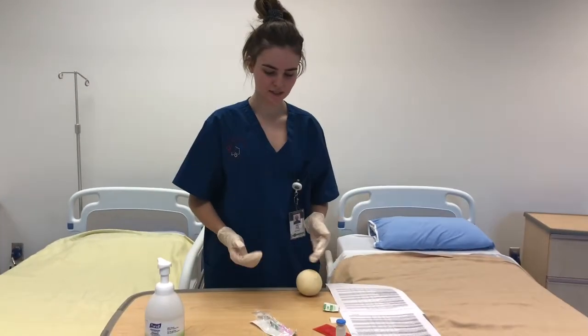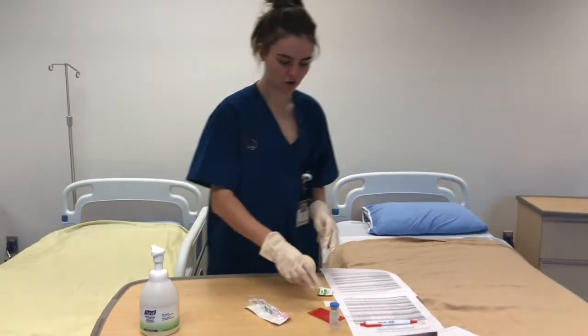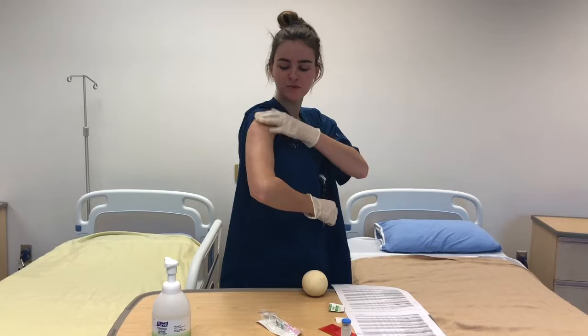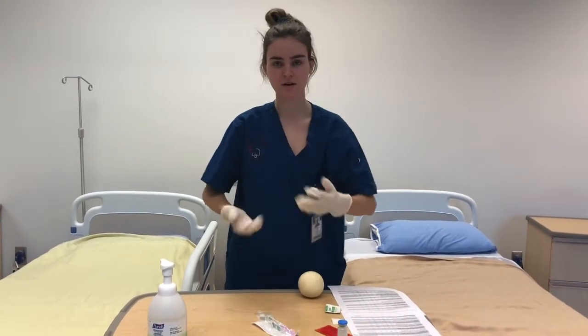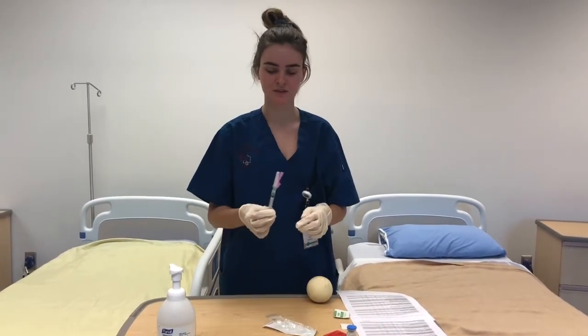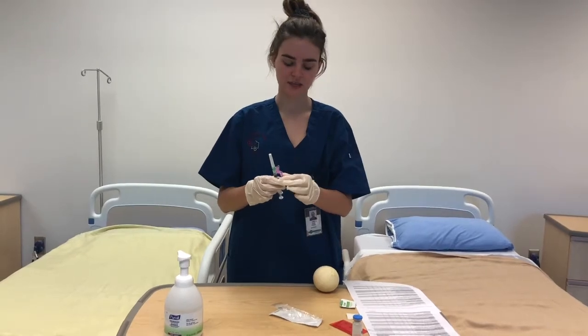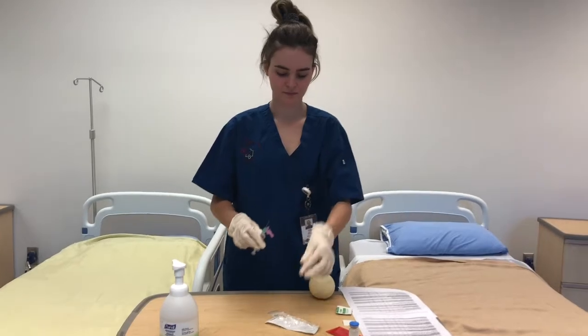Okay, so now Mr. Mancini, we're going to be giving your Haldol, which is an IM injection. So we're going to be giving it in the upper arm, which will just be a couple fingers below the bone, and given at a 90-degree angle. So we have our 0.5 milliliters of Haldol here. And I'm going to take the bevel down and remove the cap.